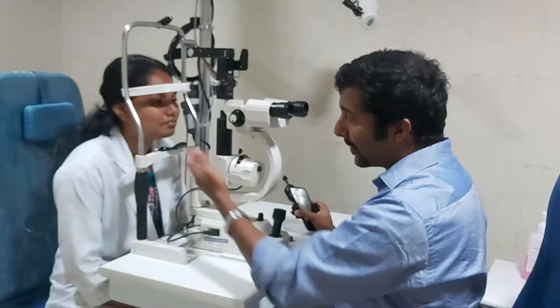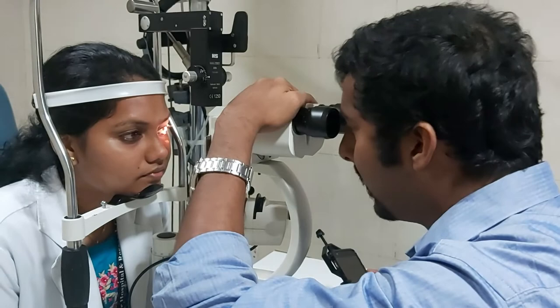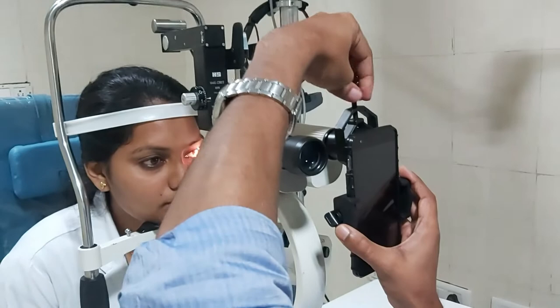Now have the patient place their chin on the chin rest. Turn on the slit lamp, look at the patient's eye, and move the slit lamp so that it is focused. Then place the adapter onto the slit lamp eyepiece.